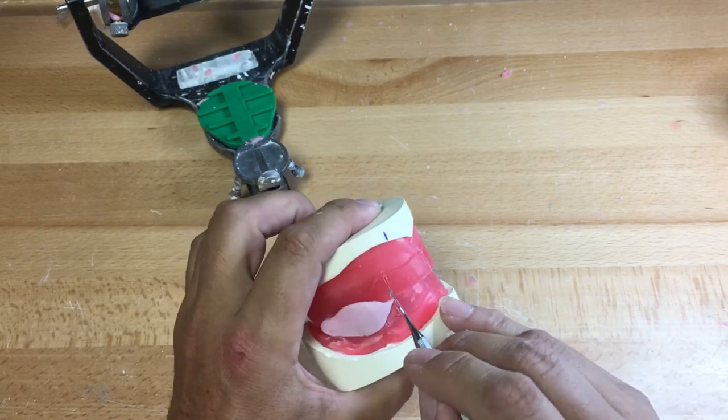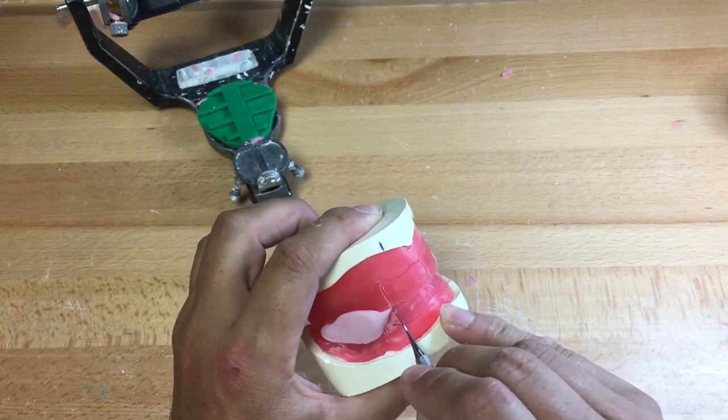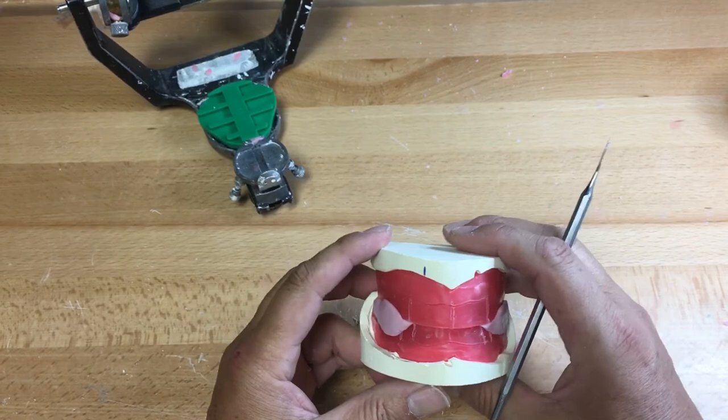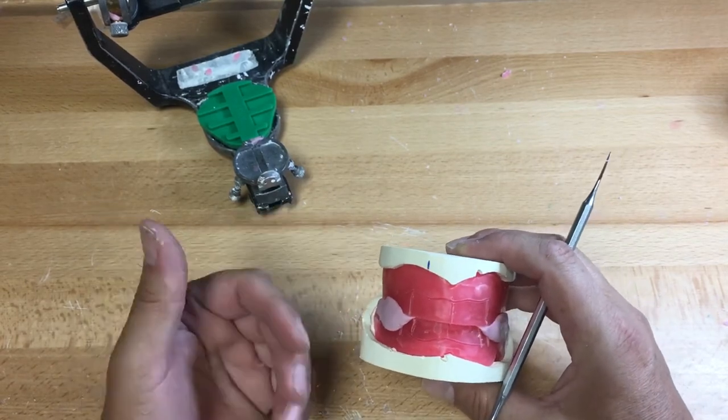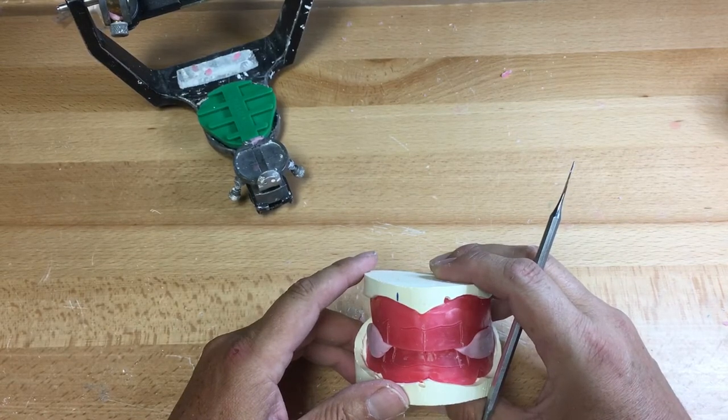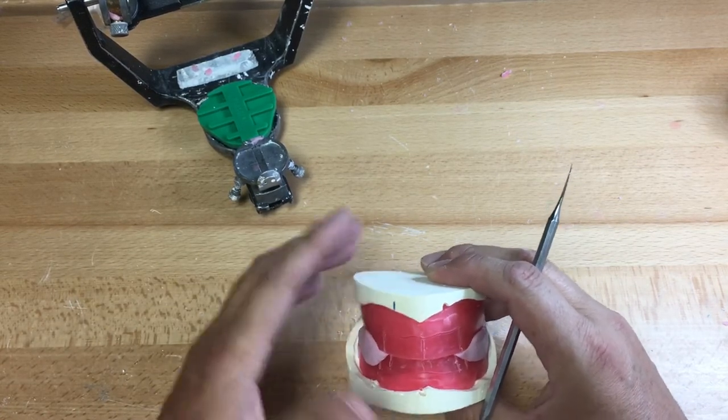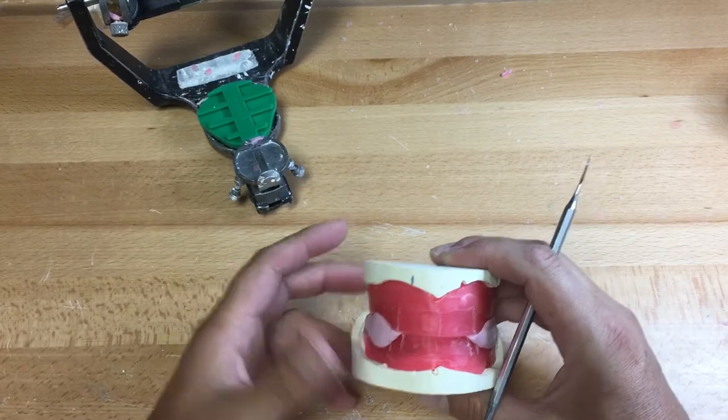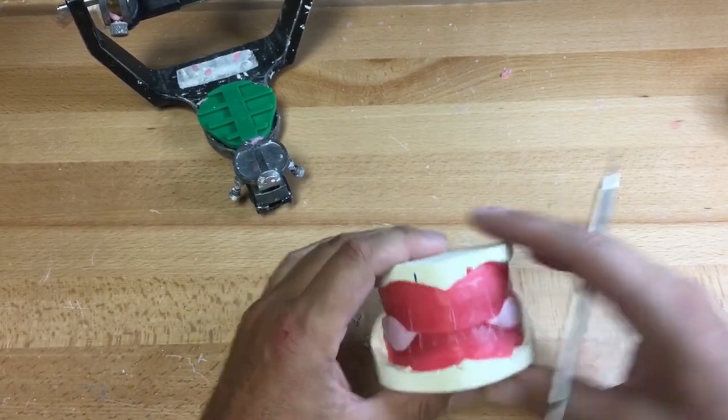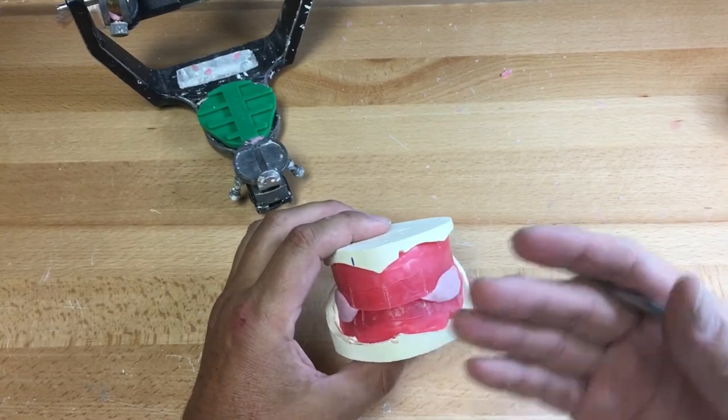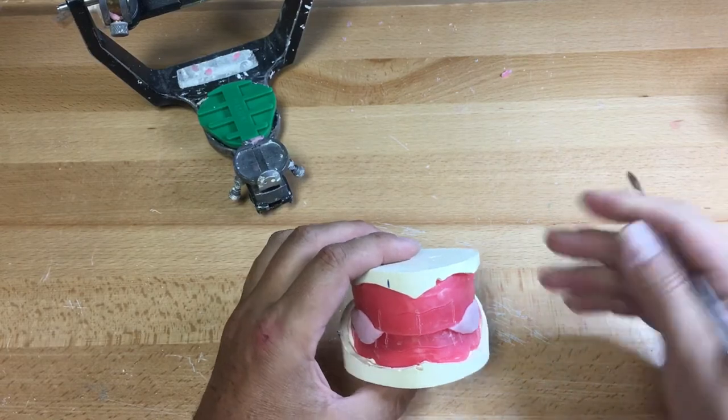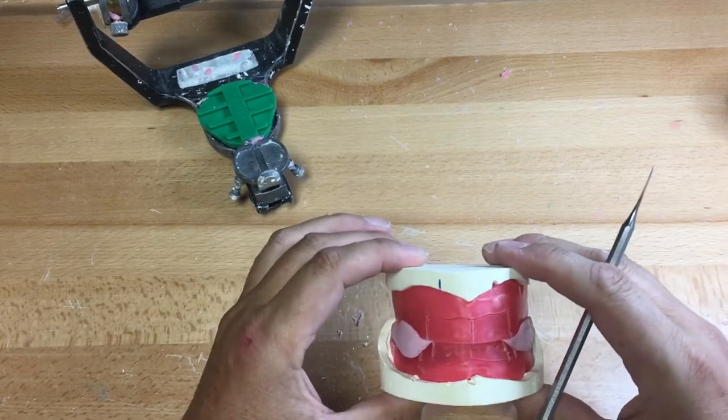Even myself as a denturist, I'll have them marked both here, as well as the canine lines, I'll bring all the way down and have the patient practice a centric relation position, which we're deeming the unrestrained position with the neck or condyle in the glenoid fossa, the most retreated position. Because this denture is not just for mastication, but we're rehabilitating the TMJ as well.